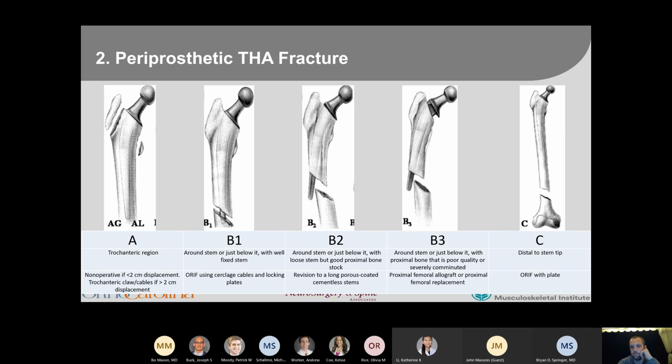And you'll also see a modular tapered fluted stem, another buzzword that they like to toss out, for the kind that you're going to use. Essentially what you're trying to do is get into the diaphysis and get control of the fracture in the diaphysis, and then fix the fracture around that so that your stem stability is coming from distally rather than proximally.